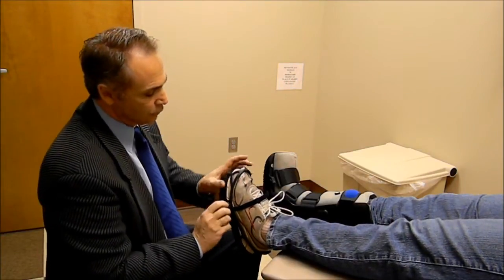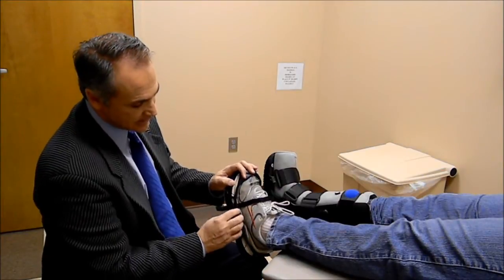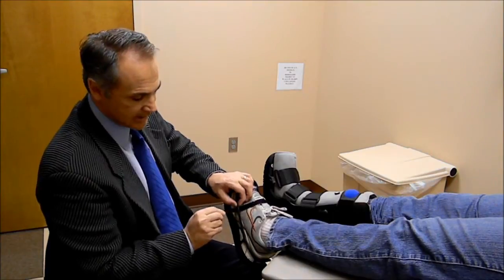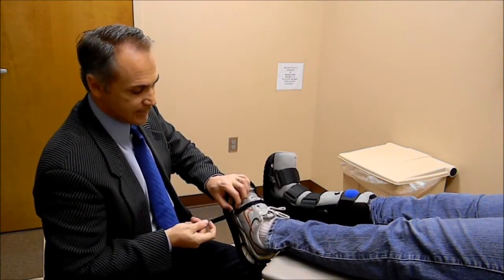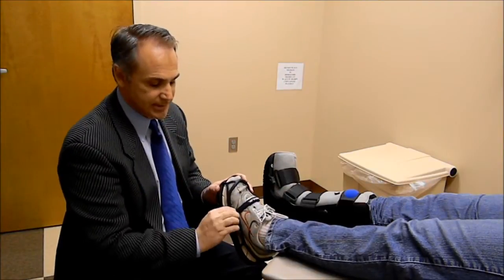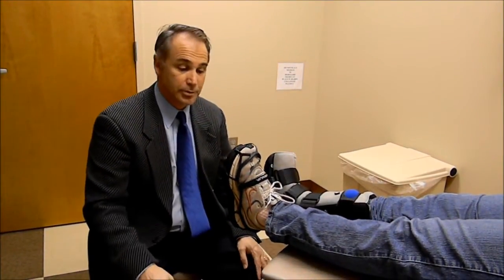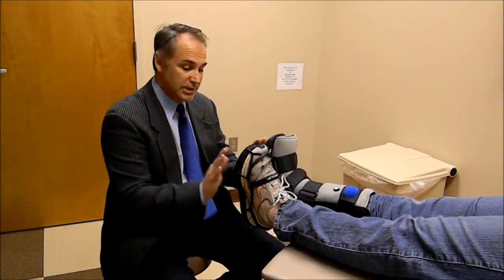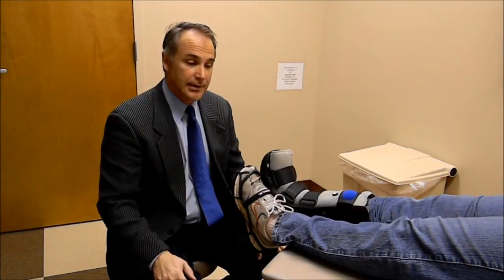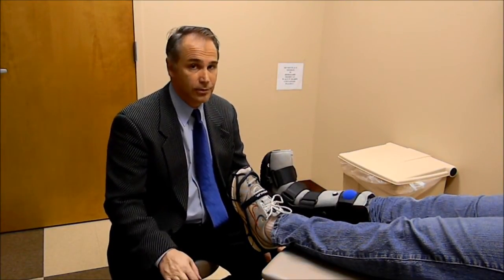There's only one thing I've seen anyone do wrong with applying the Evenup, and that is they apply it through the thin portion of the loop. What it really needs to do is go around the thicker portion and then across — this prevents it from breaking. It's very simple to put on, it makes it much more comfortable to walk, patients walk much more level, and their hip, knee, and back pain that they were complaining of is totally alleviated.